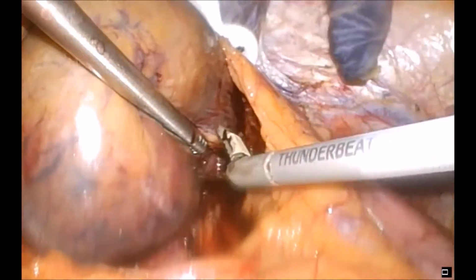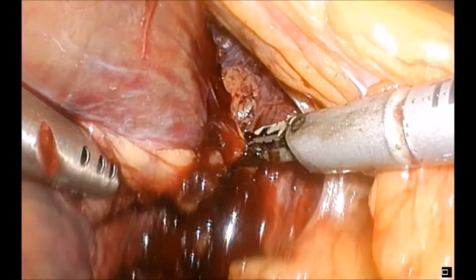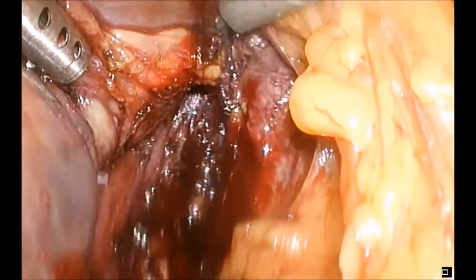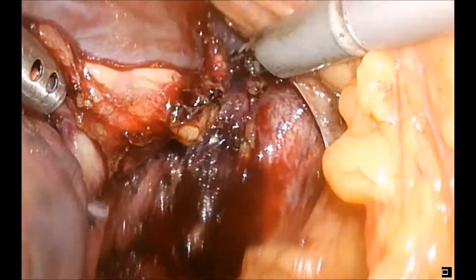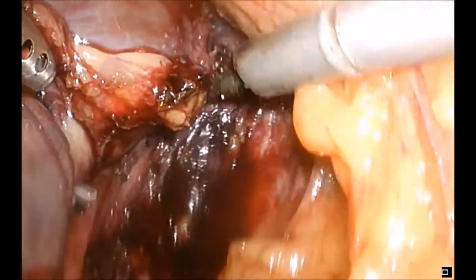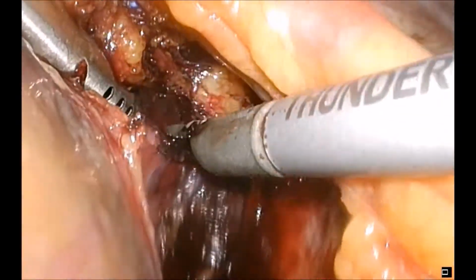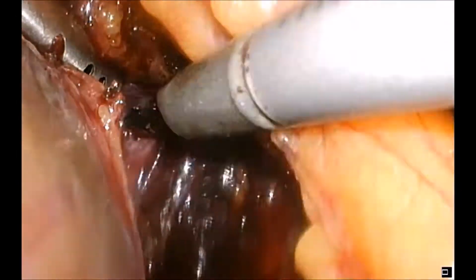You can see now the caudate lobe is essentially ischemic. It's changed in colour. It's got a very pale colour now, indicating that the blood has run out of the caudate lobe altogether. So we've probably taken all of the inflow.